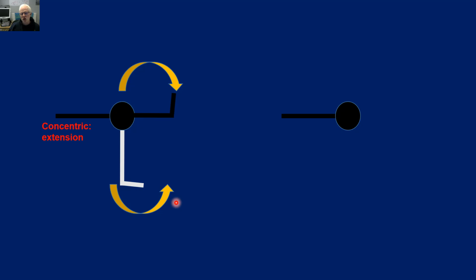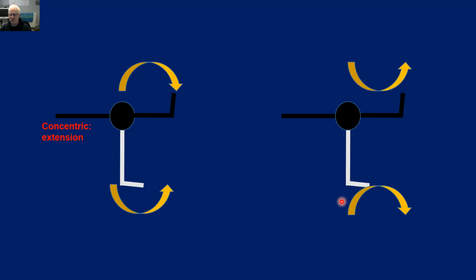So if we look at scenario 2, we're going from our position of flexion to extension, so exactly the same principle. But in this example, notice the way the forces are operating. So the limb, remember, is going to move through this range of motion.